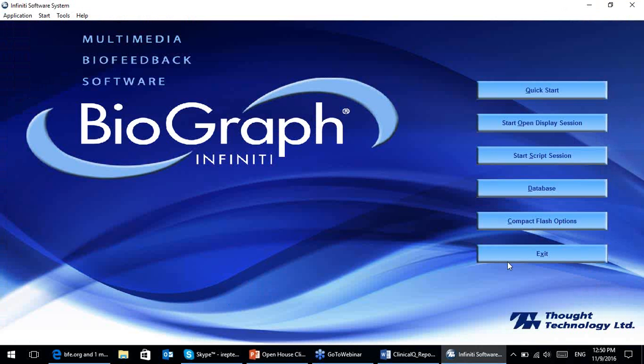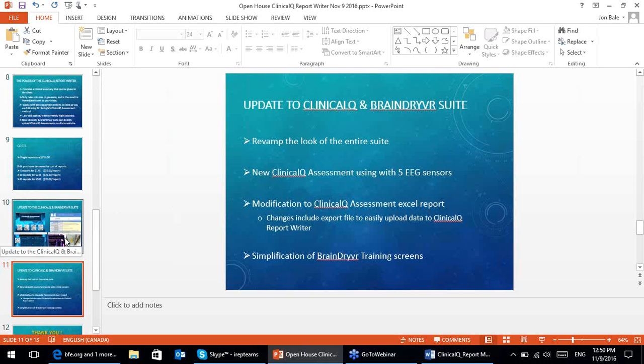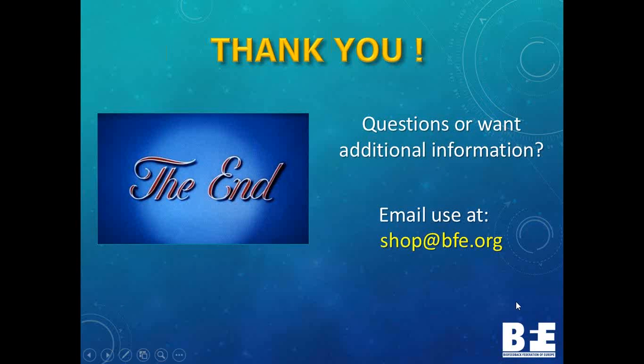So that's perfectly okay. All right, I think that's about an end to the ClinicalQ Report Writer, introduction of it to you guys, as well as description of an update to the ClinicalQ and BrainDryvr suite. If any of you have any more questions or comments for me, I would be happy to answer those right now. Otherwise, we might have to call this session an end.